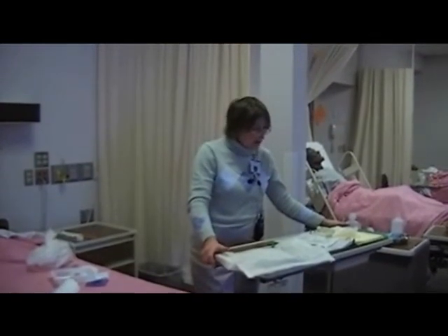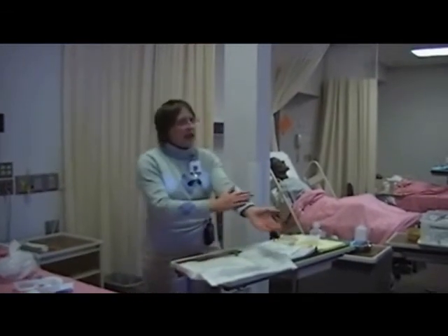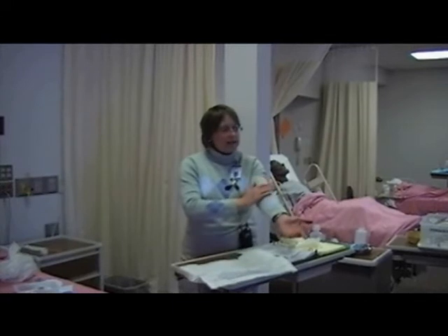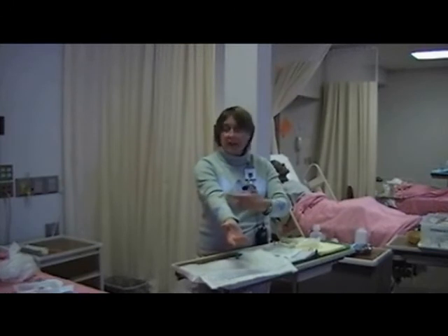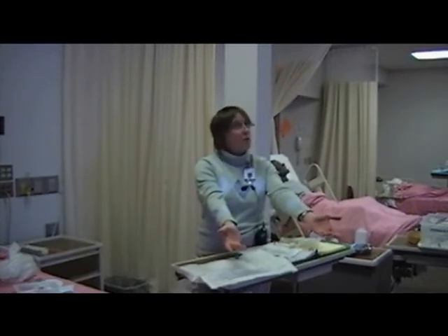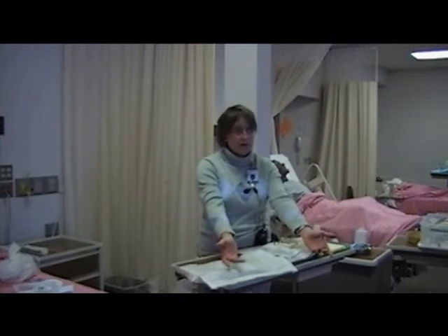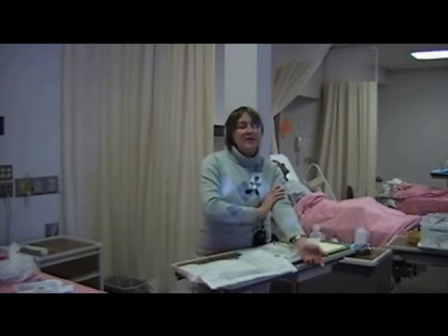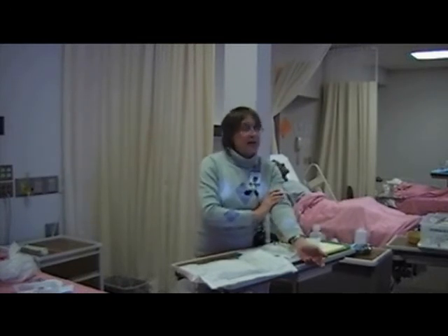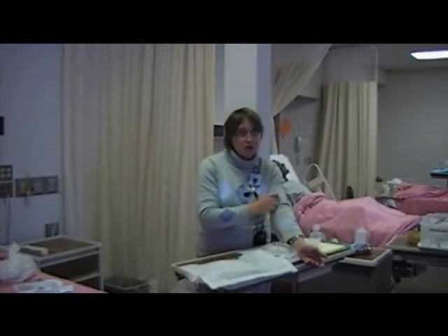How can you assess for infiltration in a PICC line? And you know this is something that we didn't discuss. So I showed you what the PICC line looks like. Now you've got a person who's got a line in one arm but not in the other. So think like what you did with the chest. Is one way you can do this? Compare. Even better than comparison, though, is actually measurements. So the nurse who will insert the PICC line will sometimes take measurements, approximately 10 centimeters above the insertion site, and document that. You may find your patient will even have lines on her arm so you know where you're supposed to put the tape measure around.